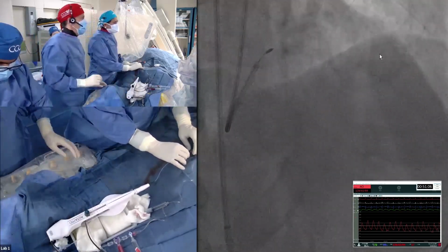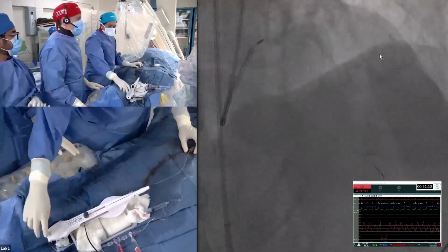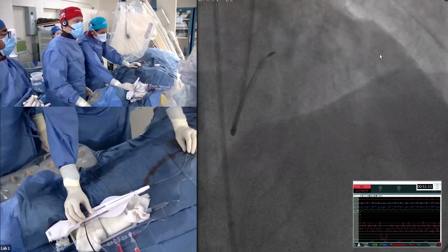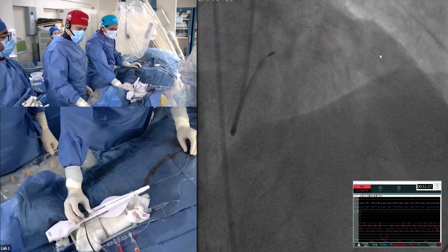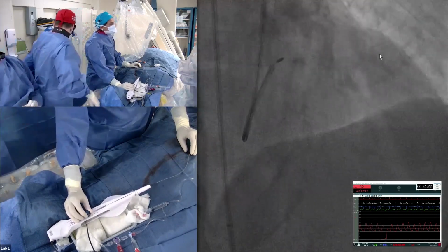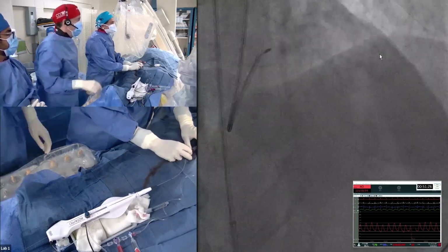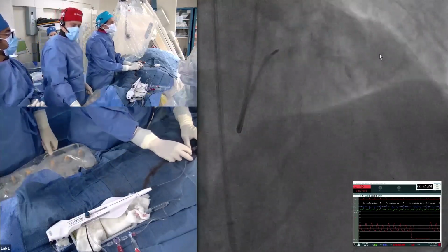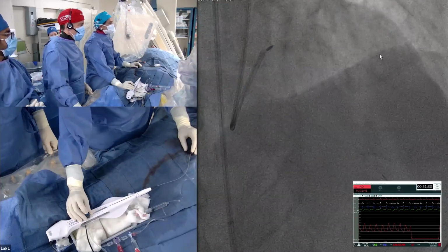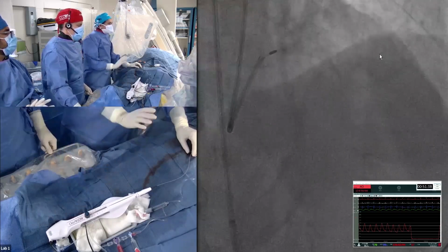So very simple. Do your 3 steps, and tell us your 3 steps on the Dynaglide. Don't assume we know your 3 steps. Okay, so here we are. If you see here, your knob: move your knob backward, forward, and any tension between the Teflon sheath and the burr is removed. Then at the Y connector, go backward, forward, and any tension between the burr and the wire is gone. And the last one, you have the Dynaglide. On the Dynaglide, do a little tap, so hopefully it will not jump. Yeah, it did not. So now it is not going forward.